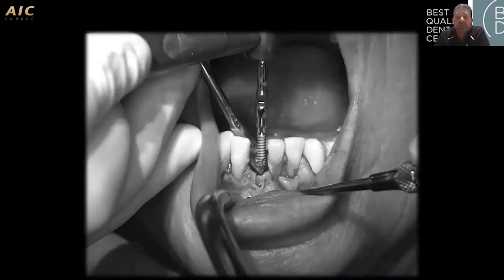In this case, my choice was a one-body implant of 2.5 millimeters. That is very well indicated for situations like lower incisors, or even for very tiny spaces after orthodontic procedures, for instance, when the roots are very narrow and we don't have enough space. So this is an excellent solution for these kinds of situations.